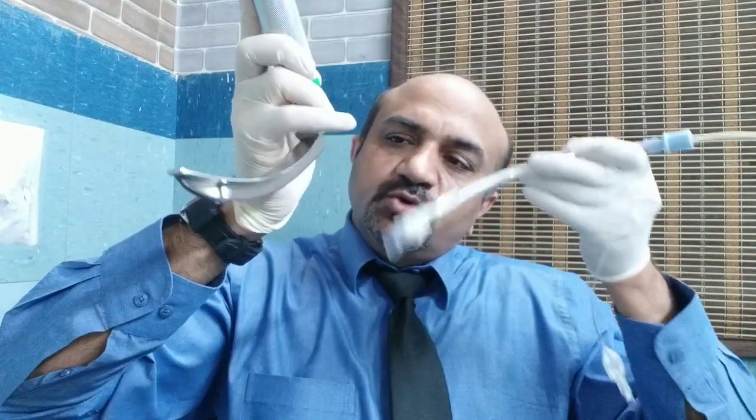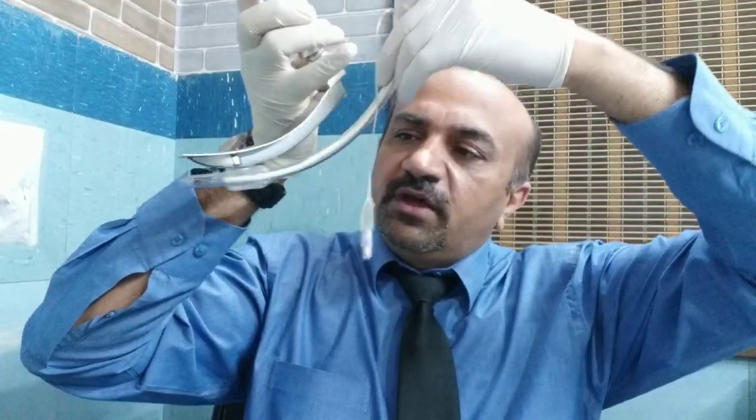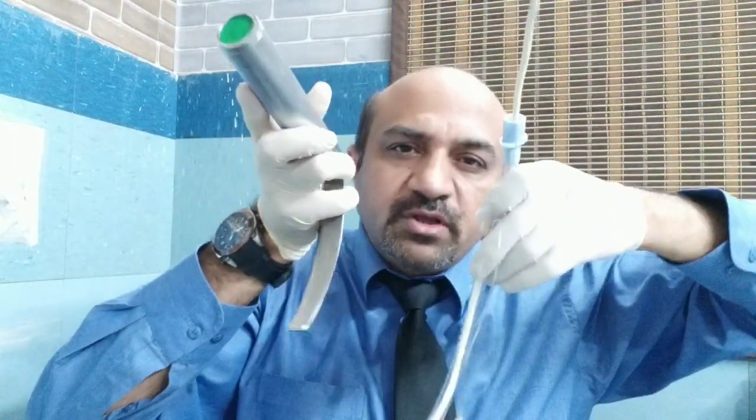This is how you apply it. You hold the handle in your left hand, holding the blade in the right hand. You approximate these two, and then you snap it this way. Whenever you are to pass the endotracheal tube and you are looking at the tracheal opening, you slide it along the blade and it will go all the way down.